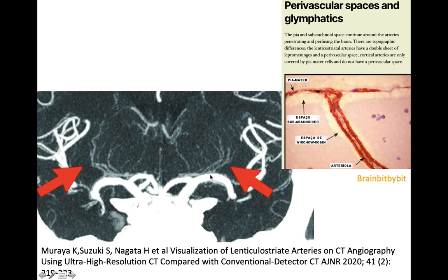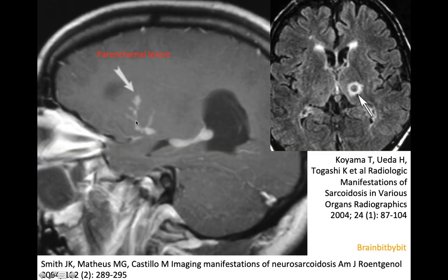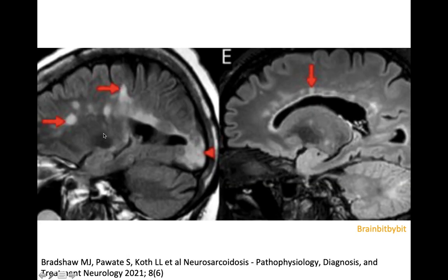Along the lenticostriatal arteries, there's a double sheet of leptomeninges and an extension of the perivascular space, in contrast to the cortical arteries. The leptomeningeal involvement in sarcoidosis can extend along these perivascular spaces, as you can also see in this patient. The parenchymal lesion in this patient is orientated along the perivascular space. Parenchymal lesions in sarcoidosis can have low T2 signal, which is helpful but not specific, because you can also see it in lymphoma and in cellular metastasis. The parenchymal lesions can also be orientated perivenular in a pattern resembling a demyelinating disease like multiple sclerosis.